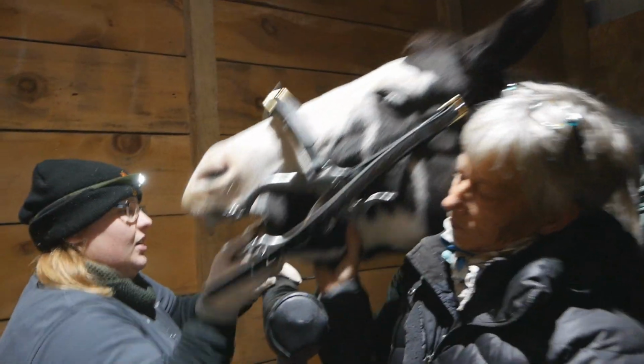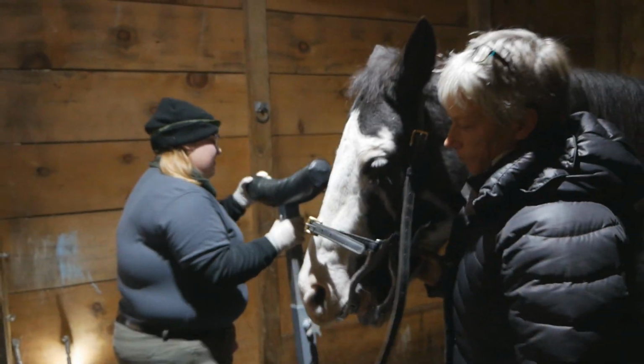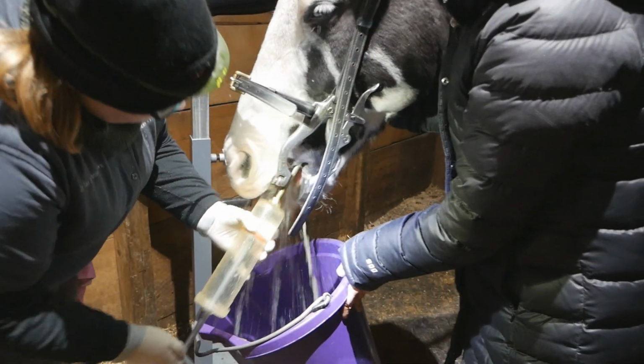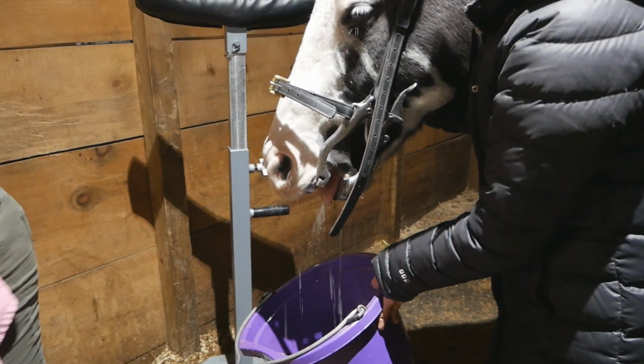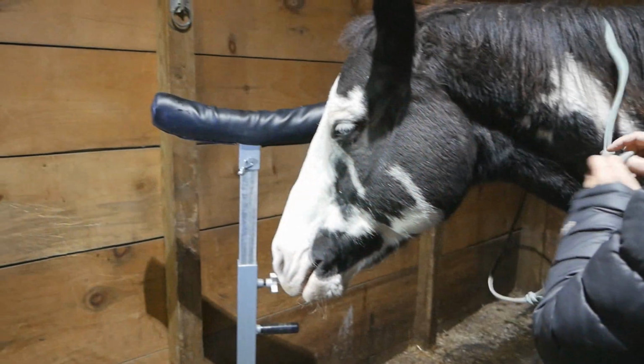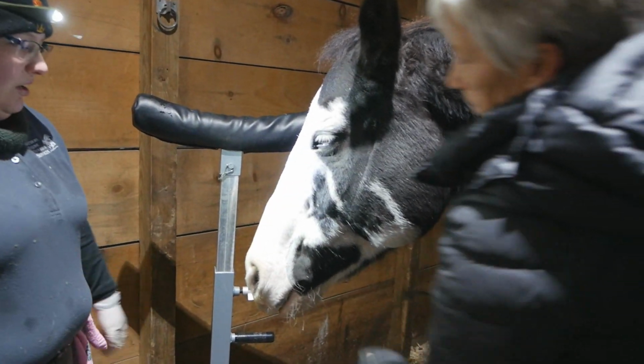Pop them off of here. Give them a good rinse, that tooth dust out of there. All right. Now we'll take a look at his incisors. Good boy.